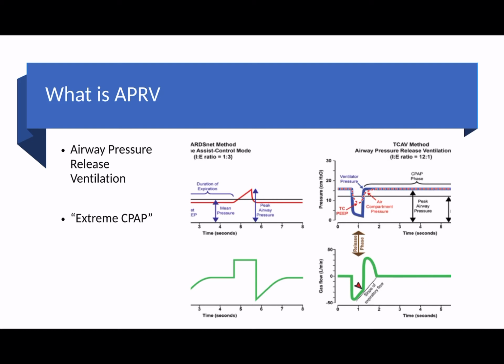The way to think about this is if you're driving down the motorway in a car, you put down the window and you stick your head out the window. That continuous rush of air that you get, that expands out the lungs and therefore opens up those alveoli that are collapsed due to the weight of the mediastinal tissues, the chest wall pressing down on the lungs, and the abdominal contents being pushed up through the diaphragm onto the bases of the lungs. So you're basically recruiting up all those unused bits of lung and therefore increasing the efficiency of oxygenation.